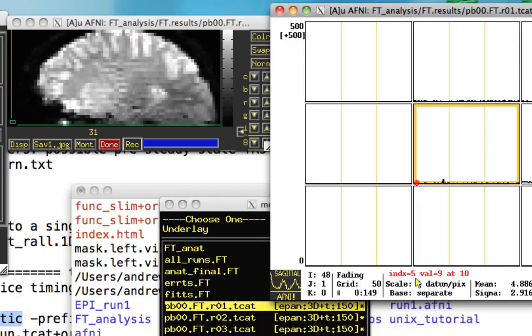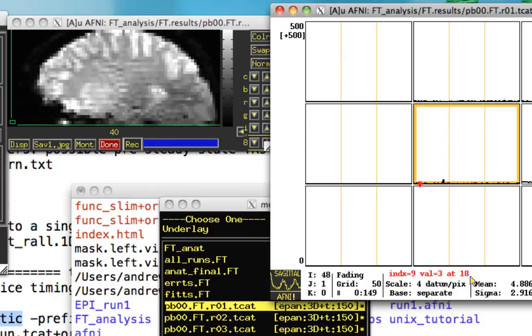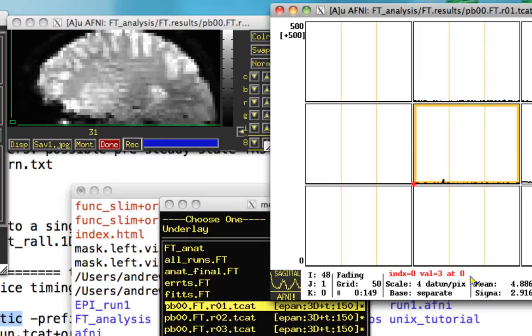And every time it increases, the time in seconds increases by two seconds. Because our TR, repetition time, was two seconds.